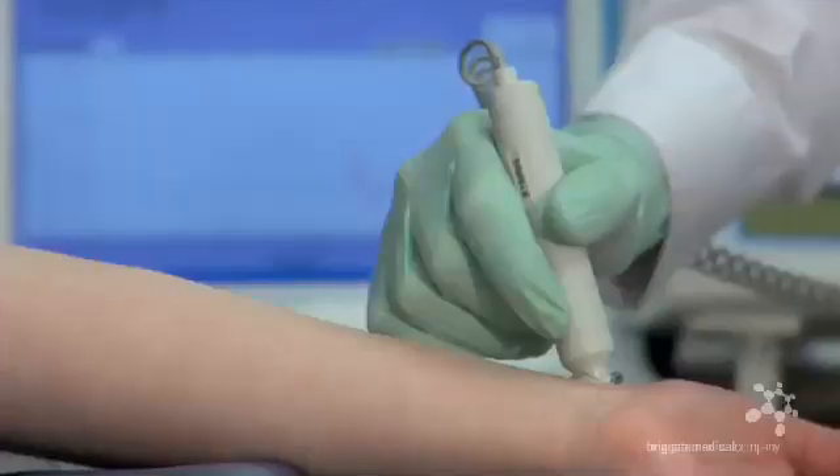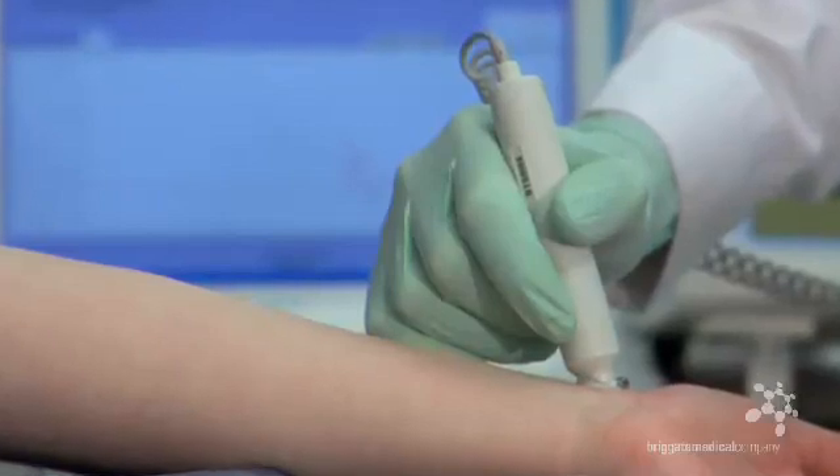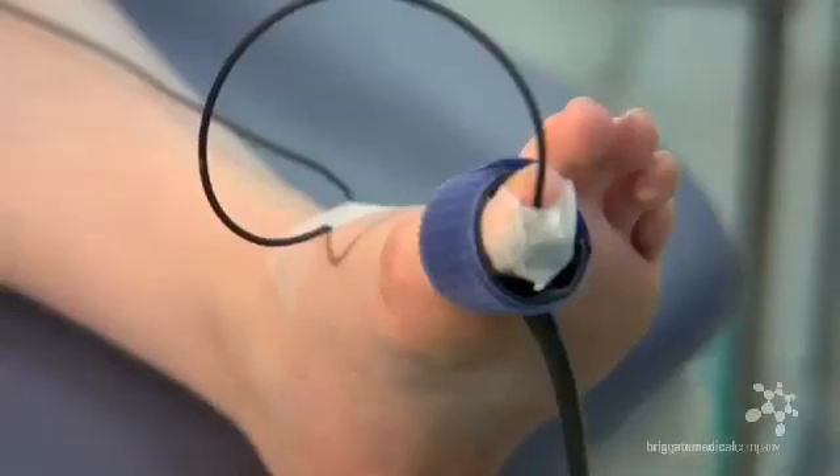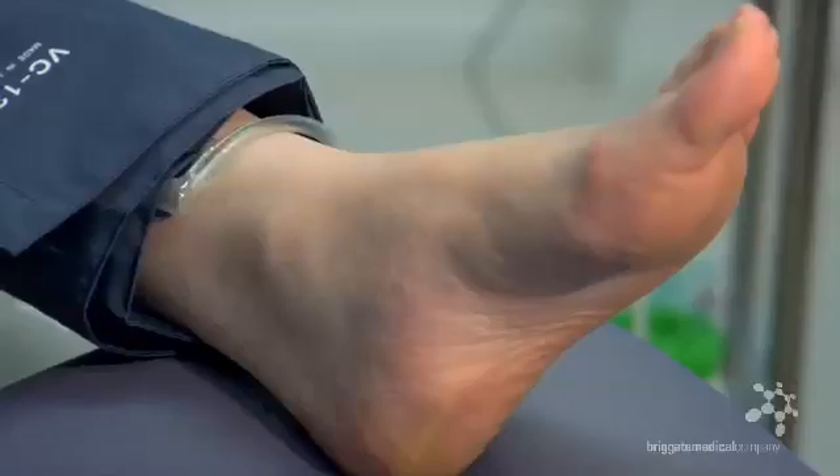For the purposes of this demonstration we shall start by obtaining a brachial pressure. This does not have to be the first pressure point taken. You may decide to start with the toe pressure and then move to arm or brachial positions, followed by the ankle position.